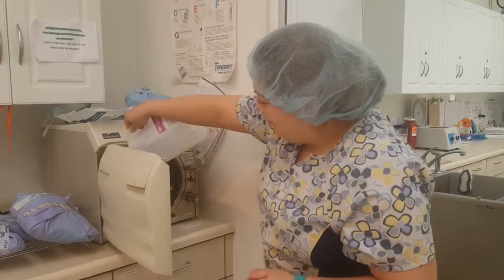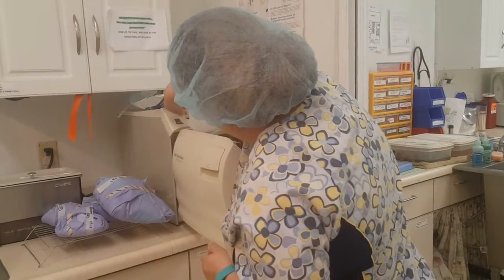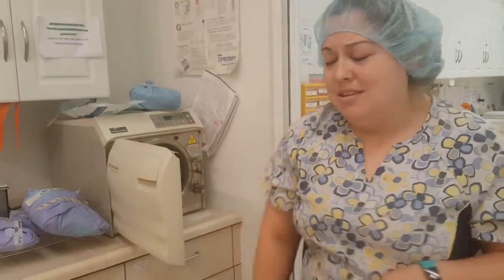I'm going to start by adding some water to our autoclave because ours is a little low. Always check with your autoclave to see what it needs. Ours uses distilled water.